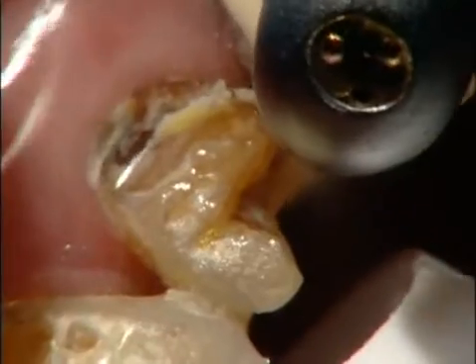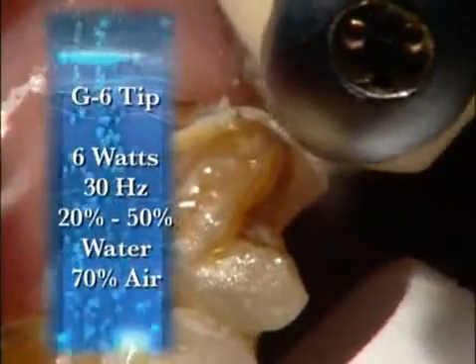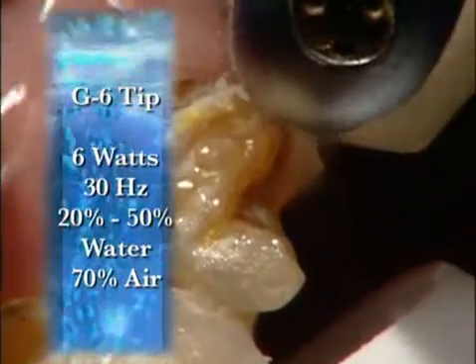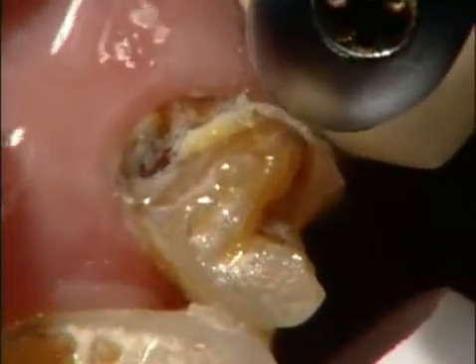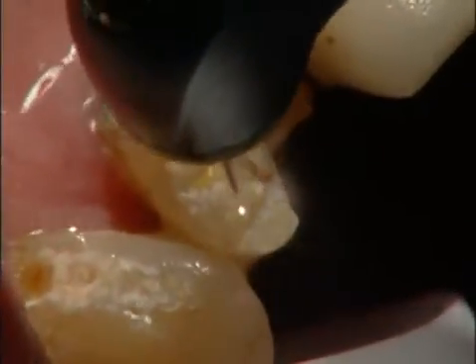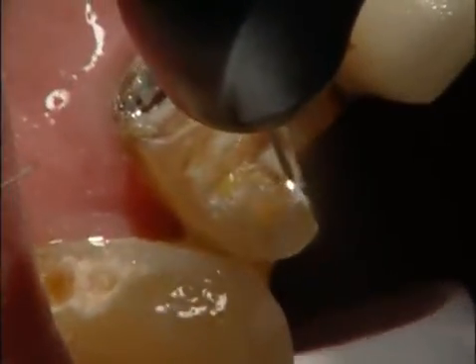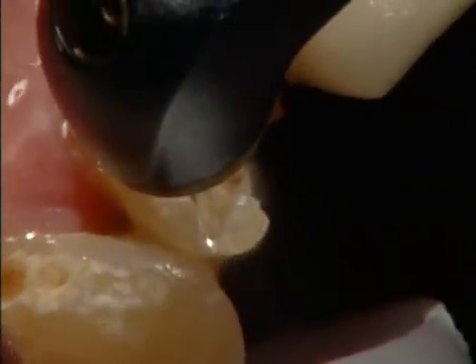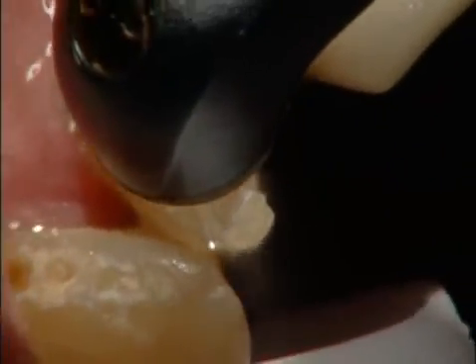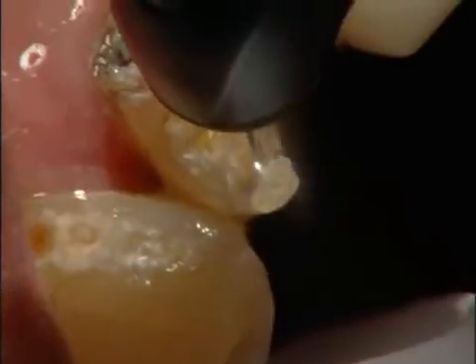At 6 watts, 30 hertz, 20 to 50% water, and 70% air. So the same guidelines in doing a crown prep we follow as we would using high speed: the incisal occlusal reduction first, then interproximal reduction.